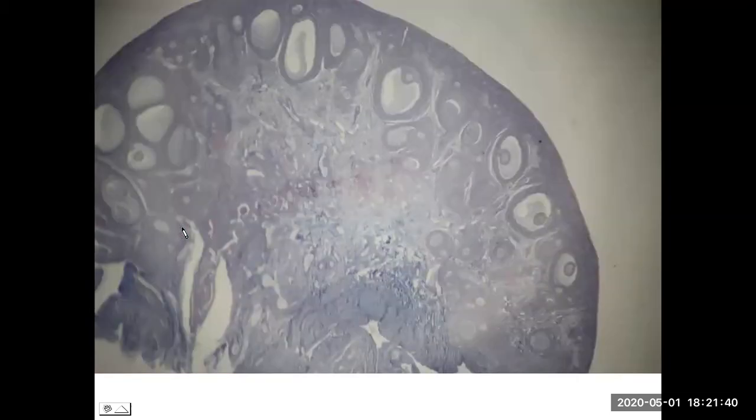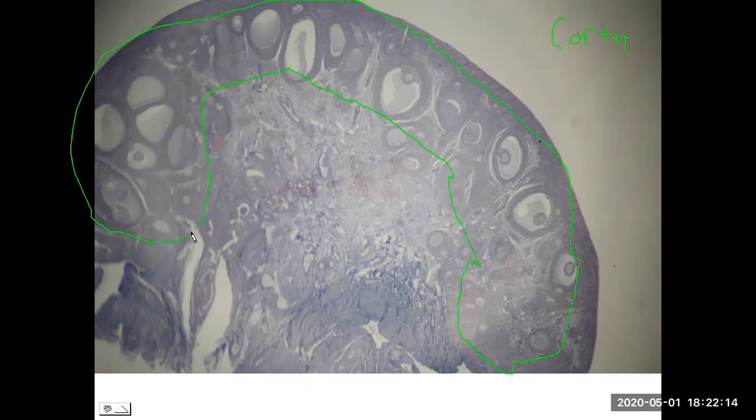And then moving on to the female reproductive system, there's the ovary. So starting near the surface, not the absolute surface, but near the surface, and we'll zoom in to see the area of the tunica albuginea. The ovarian cortex, and once again, the cortex is the superficial portion. And in this case, the cortex is the area that contains all of the follicles. So I'm roughly kind of highlighting here the superficial area that contains the follicles, and here's an example of a follicle, are found in the cortex. And the area that lacks follicles, this is the medulla of the ovary.